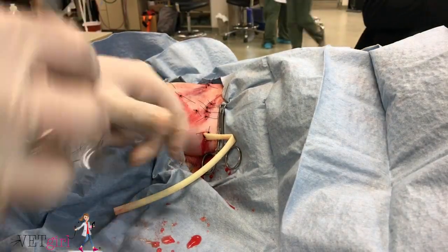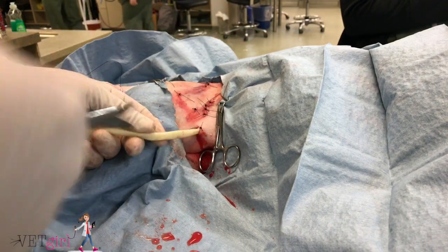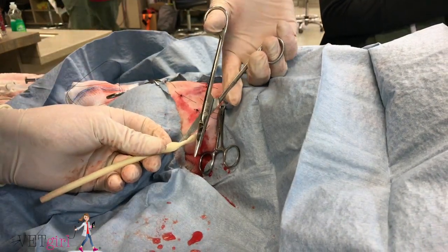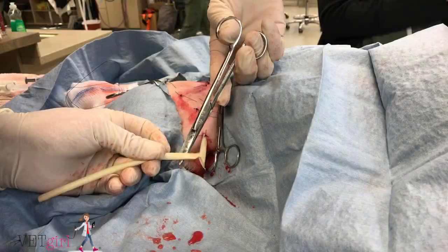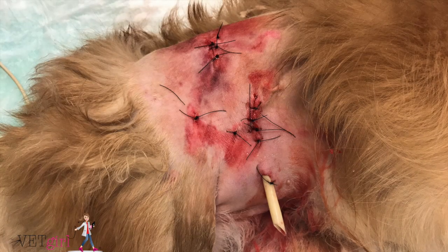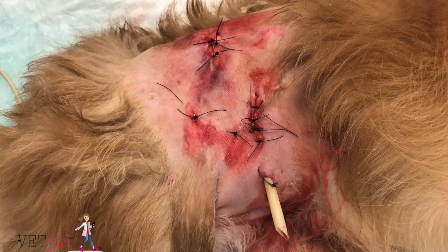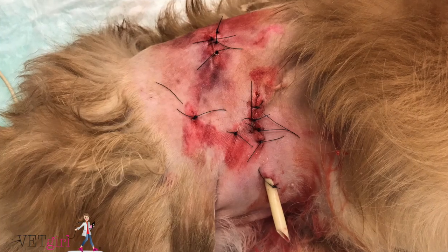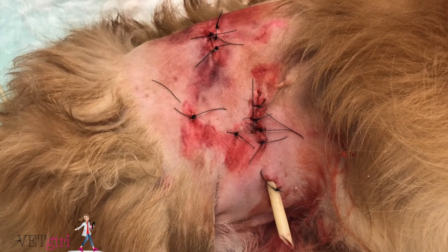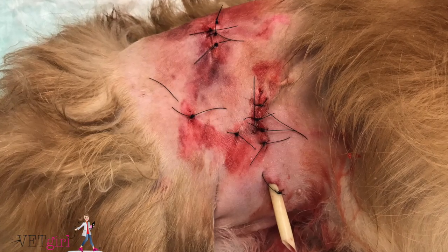A drain such as this often remains in place for two to four days. If there is no notable accumulation of fluid at that recheck period and the incision appears to be healing appropriately, the drain is removed in two to four days, followed by removal of the skin sutures in 10 to 14 days, ensuring adequate complete wound healing.